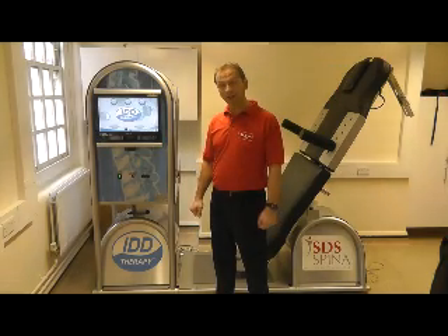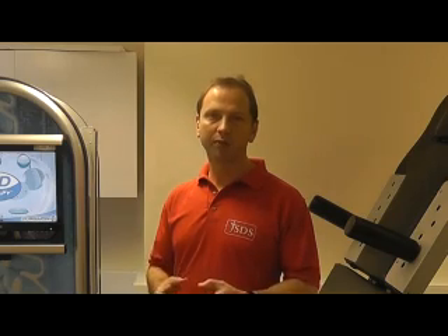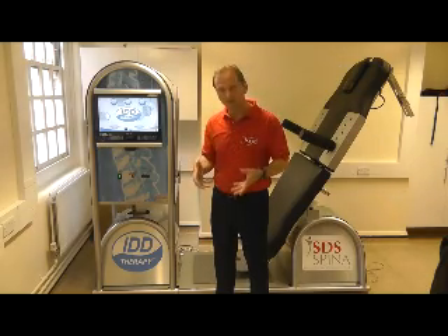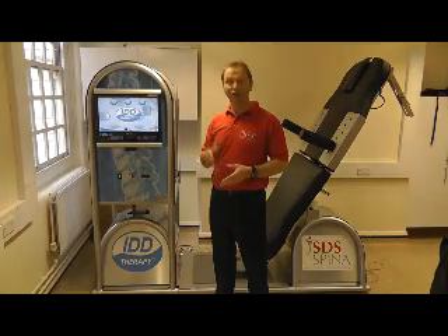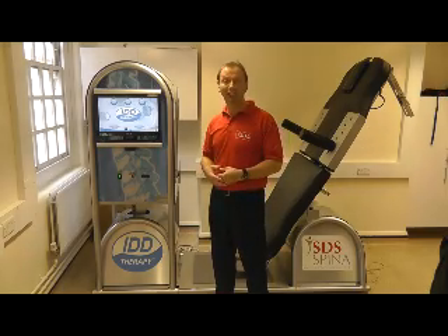One aspect of IDD therapy treatment is the amount of pulling force used to distract and mobilise targeted segments of the spine. We have a certain amount of physical strength which is adequate to resolve many back pain problems, but there are times when we're trying to decompress and mobilise segments which have become stiff and immobile, making it very difficult to mobilise the spine just using the hands. I'm going to highlight the reality of the pulling force which the machine can exert.